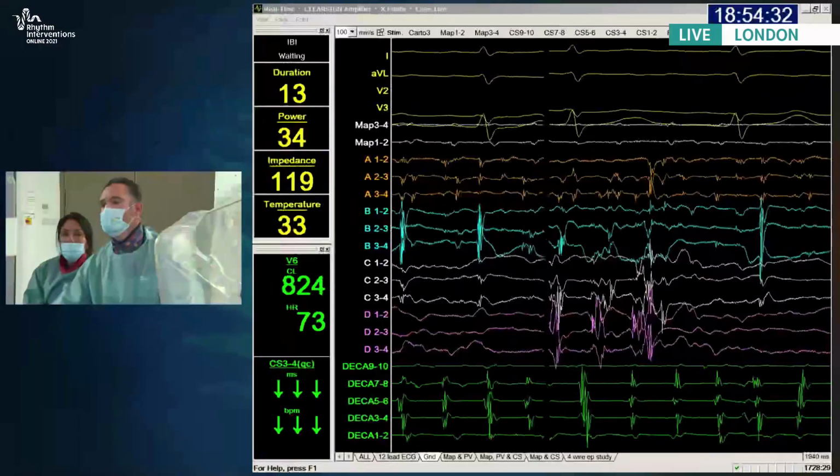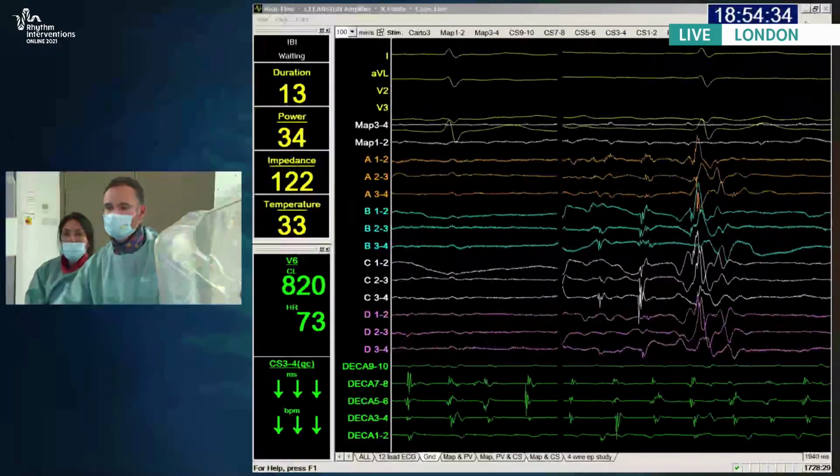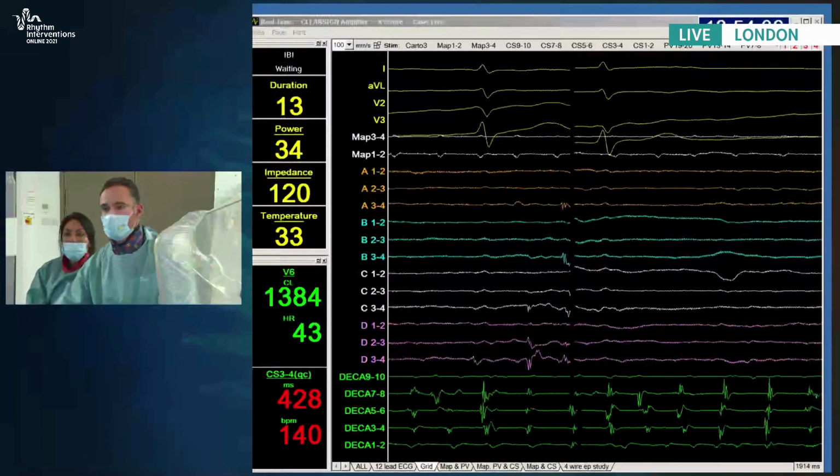Oh, I think it's a huge issue. It's one of the real limitations of our old ways of looking at CAFEs and fractionated electrograms, and also voltage maps. If you're voltage mapping in AFib, the signal amplitude is very much affected by directionality. So I think that's really where a catheter like the HD Grid has real potential value. A lot of this is obviously in evolution.